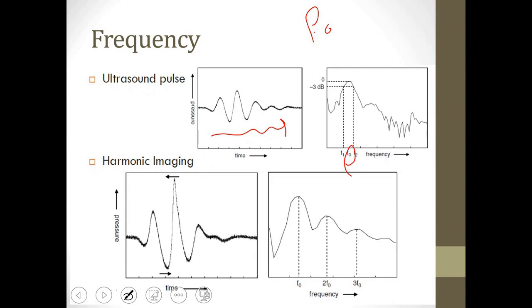The bandwidth is the range of frequencies that come out with the pulse, meaning the pulse itself has a frequency, but you can select the preferable frequency for you, which is the central frequency, F0, at the maximum. So, can you choose any value from the frequencies within the bandwidth? Yes, you can, but this varies from one probe to another. The Q factor is present according to a need, and we will talk about it shortly. It determines the bandwidth of the frequencies present, specifying whether the range of frequencies is large or small based on this Q value, or Q factor.